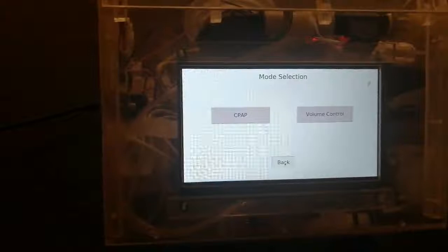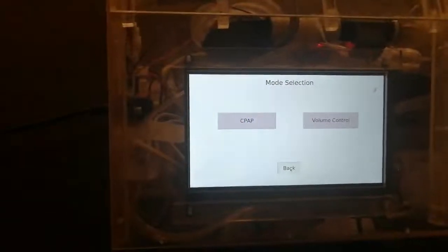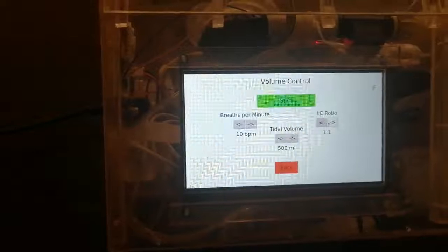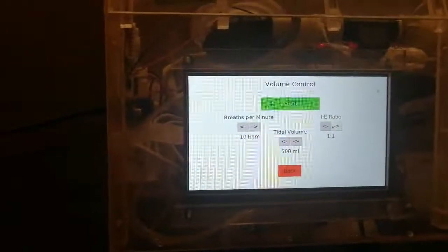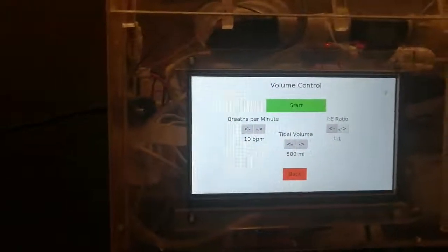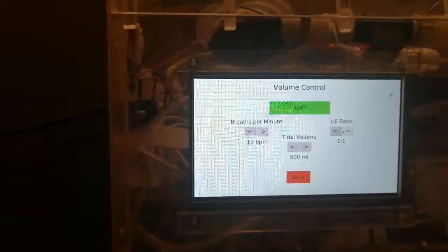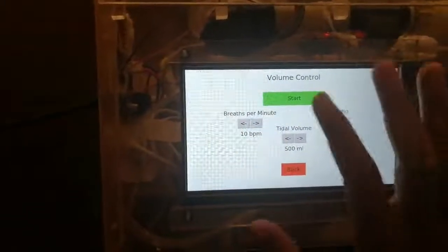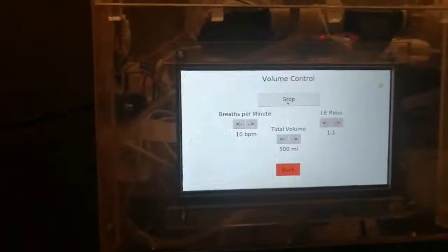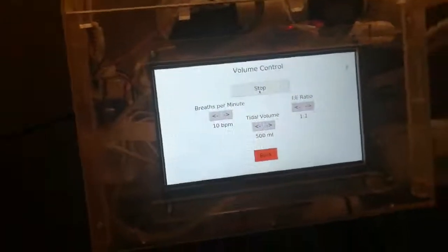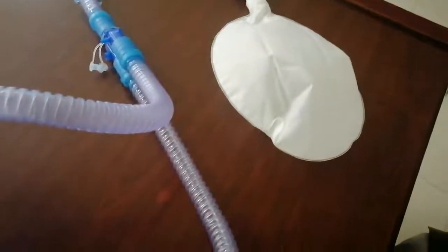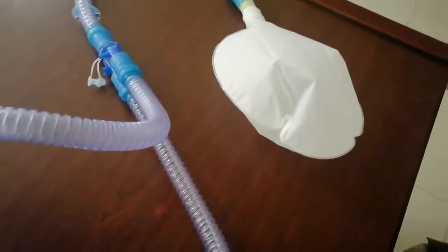Next we have a volume control mode. Press the volume control button. In volume control mode you can configure breaths per minute, IE ratio, as well as tidal volume. You can start with the default values. In this operation you will see inhale and exhale cycles repeating.